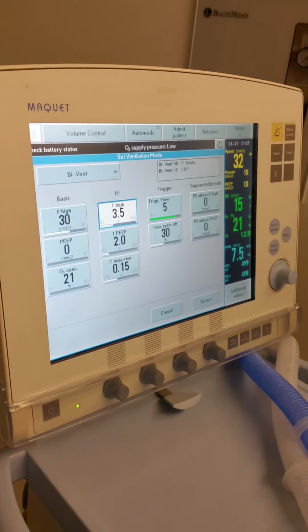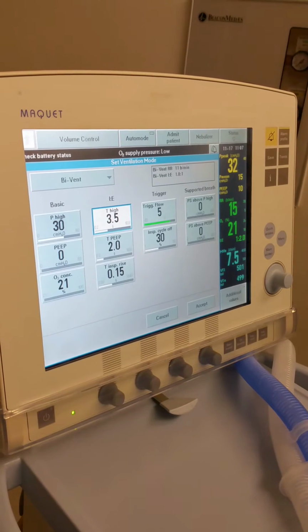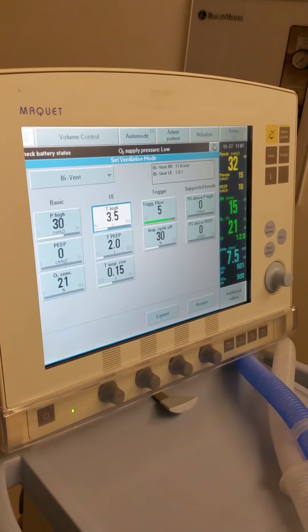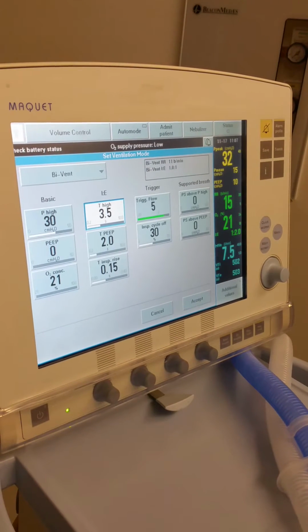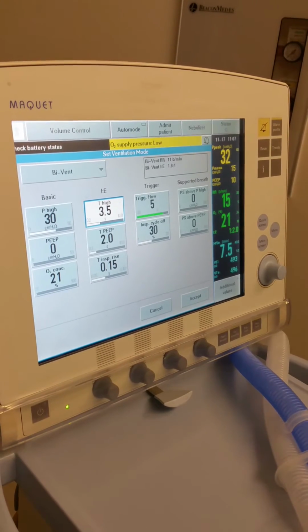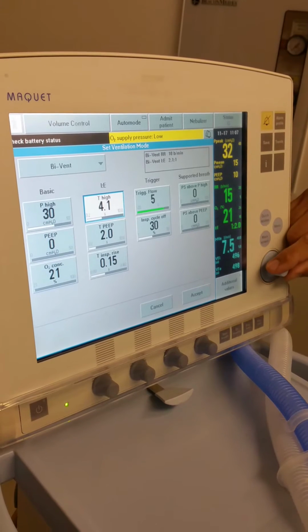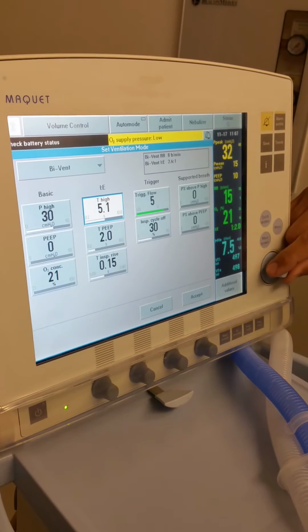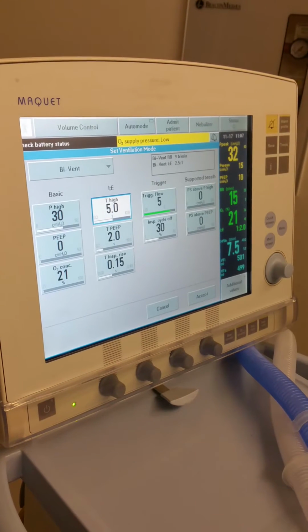if that patient is spontaneously breathing, they're probably going to be breathing in the 30s. If you look at what their spontaneous rate is on top of this, they're usually going to be a little bit tachypneic. But that's okay. You want them spontaneously breathing. So, let's say I'm going to just go ahead and set it at 5, okay? You can see it's just going to bring the rate down, but we're going to optimize our mean airway pressure. And then our T low, where do we usually want to be?